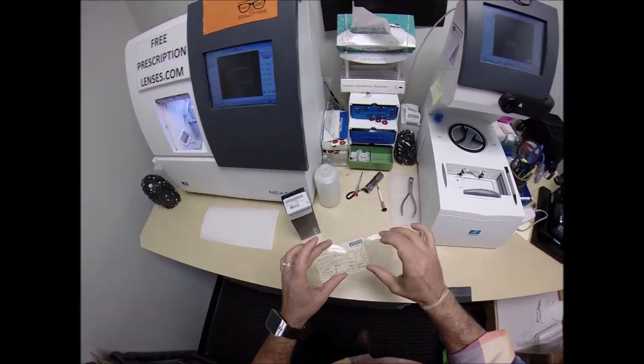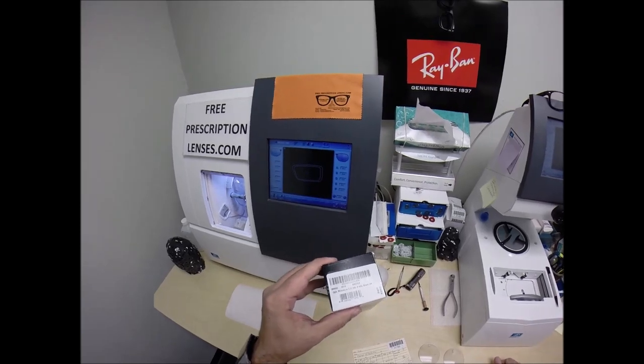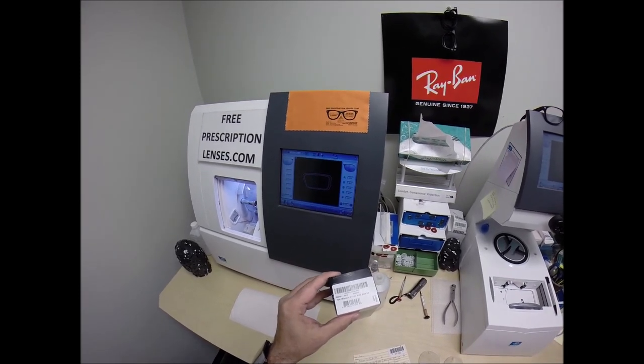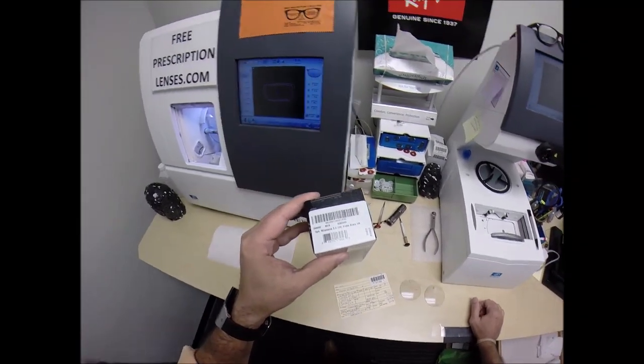It's a digital freeform progressive lens with transitions gray for your Oakley 8093, which is the Milestone 3.0, the 49 eye size, and the color 02, which is the matte black ink.